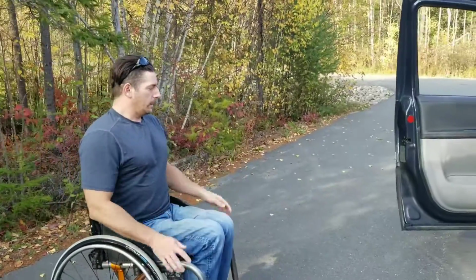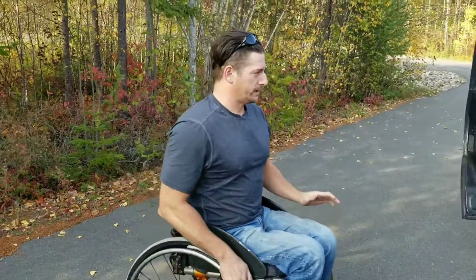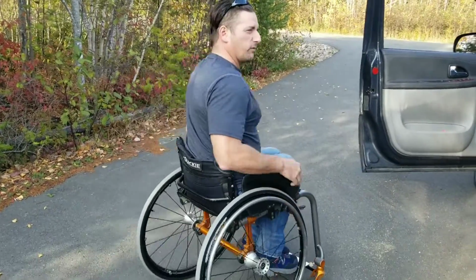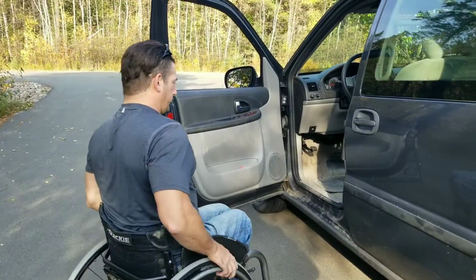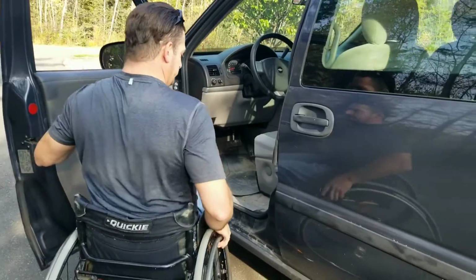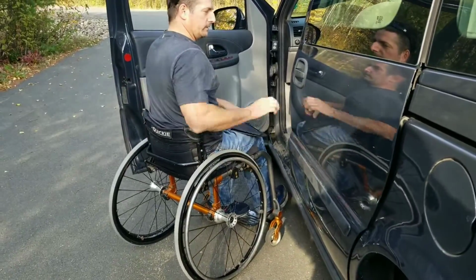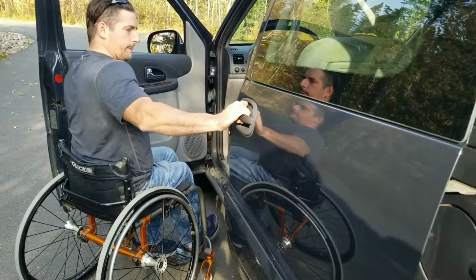So the first way I'll show you here is the very first. This is how I was taught when I was in the Stan Cassidy Rehabilitation Center. This is how I was taught to enter my car, and I used this for probably about a year. So what I would do was move up to the vehicle at an angle. I take my side guards off, take all the loose moving parts off. I'm going to just pop them in here, in behind my seat.